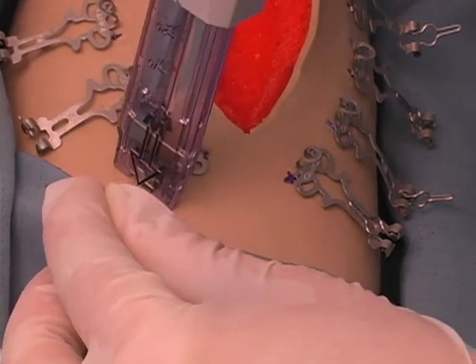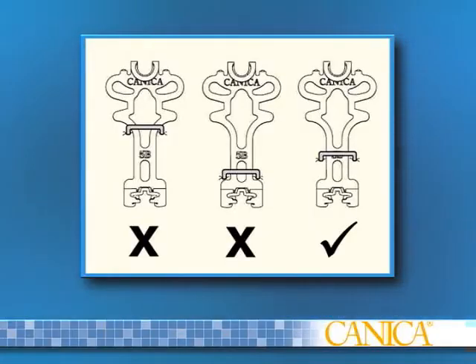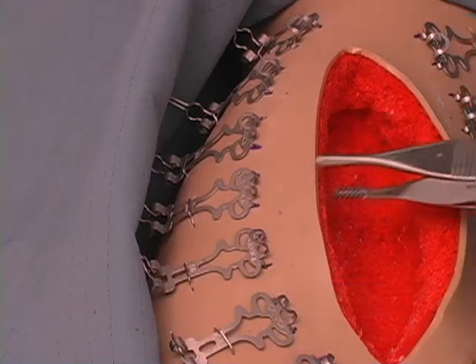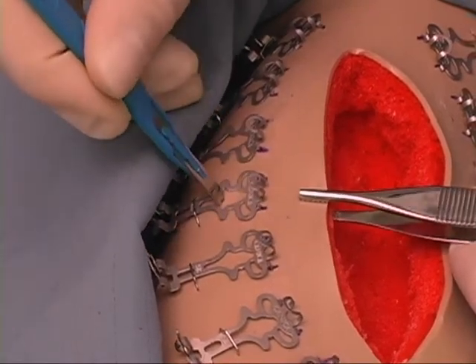Staple or suture each skin anchor to secure them to the skin. It is important that the staple position lies over the center of the rear land to allow the skin to stretch while the wound margins re-approximate. Using the center hole of the skin anchor as a landmark, make a stab incision with the lancet.